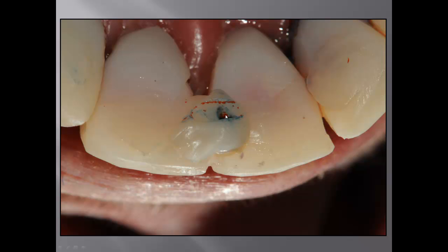So that bite registration material is going to be transferred to the technician. Then I'll take another final impression, keeping these 8 and 9 temporary crowns with the same deprogrammer, and I'll take another impression of the prepped teeth. This way, my technician can do cross-arch mounting of the models and can create the final restorative crowns at the position I want.